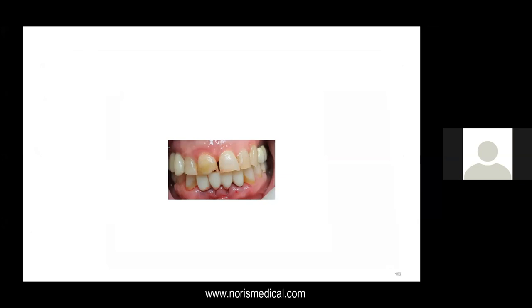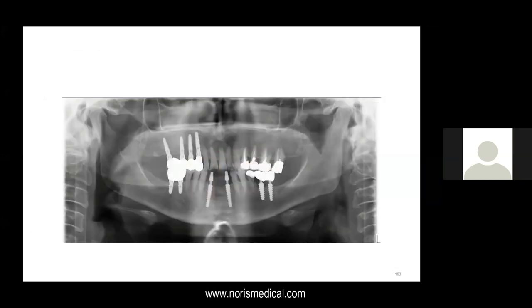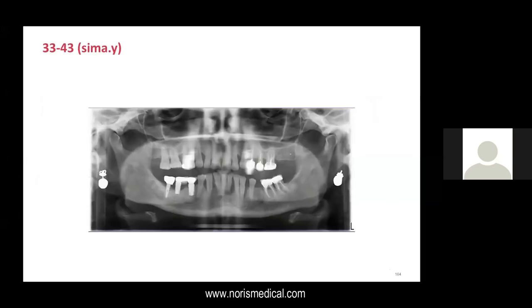Again, a little bit light, but here after 4 months, we finished the work. I try in these cases to put the crowns a little bit submerged and not touching occlusally. Here is how it looks, as you can see.